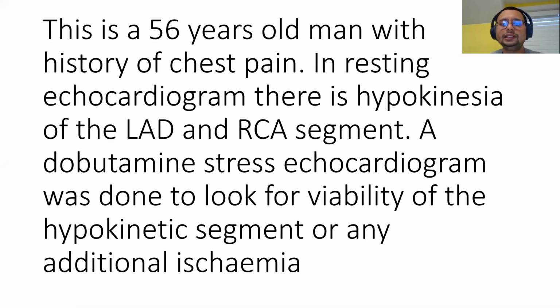So this is a 56 years old man with history of chest pain. When you look at the resting echocardiogram, you see that there is hypokinesia in the LAD and right coronary artery segment. So what you want to do now is a dobutamine stress echo to look for the viability of the hypokinetic segment, or if there is any additional ischemia.